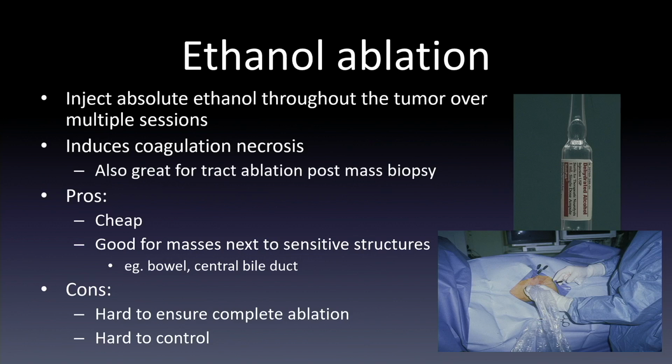And I do have a partner who did an entire ablation with just ethanol of a papillary renal cell, and it was completely treated. It's cheap. You can use it next to sensitive structures, but it's hard to ensure complete ablation.